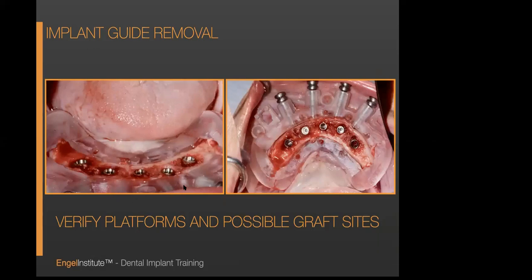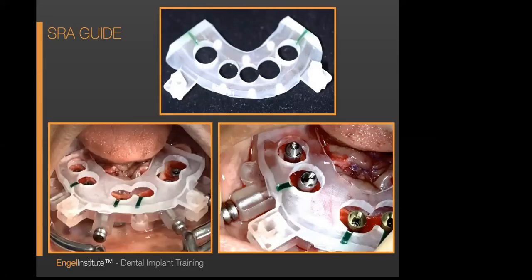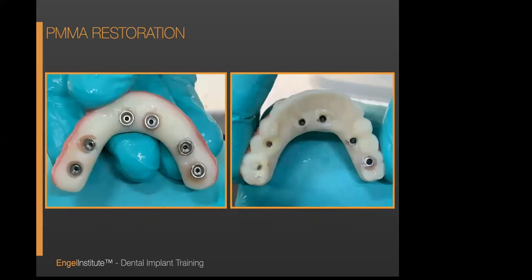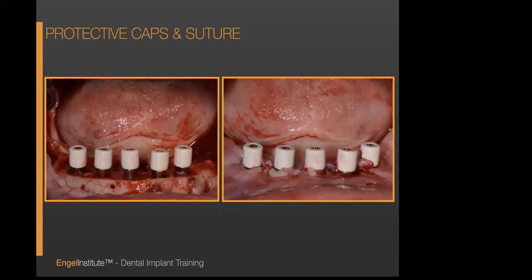Basically, reduce the bone, put my guided implants in, put my abutment guide in, which 3D Diagnostic also provides. The green lines are indications of where you want screw holes coming out. Here is all of the pre-cut titanium abutments that are also provided in this kit from 3D Diagnostics, as well as the silicone chamber. And through several processes, we make a PMMA. And this is a surgical repositioning of the flap.